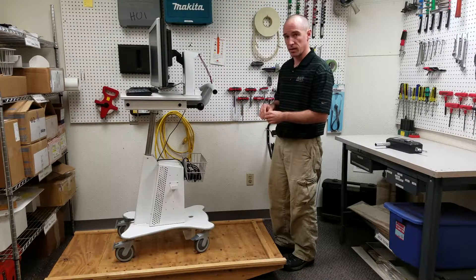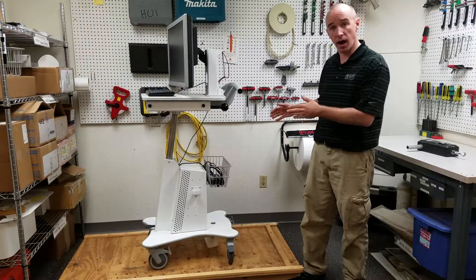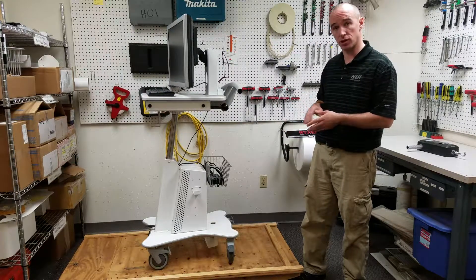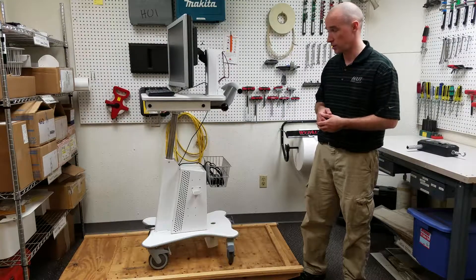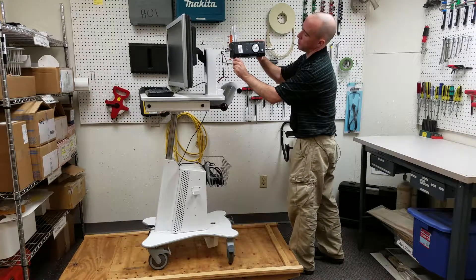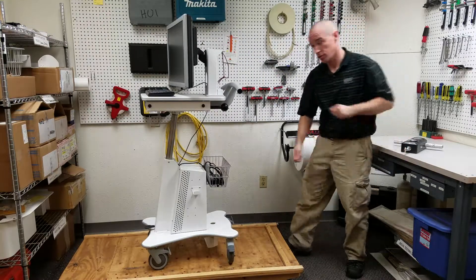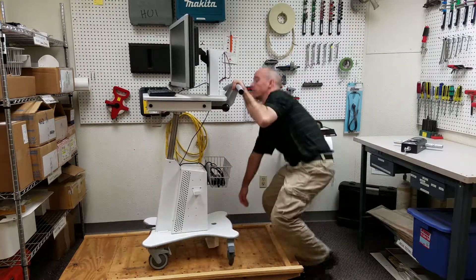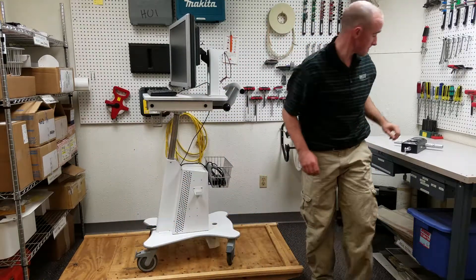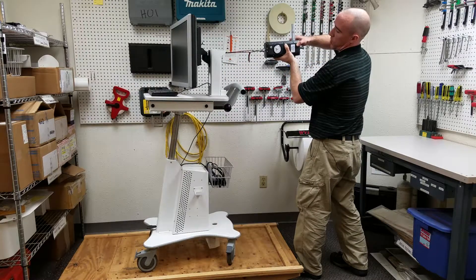What we'd do to fix this is move one of those locking wheels to the opposite corner so that we have equal braking forces on the cart. We've changed the configuration of our casters — now we have locking wheels on opposite corners. We're going to rerun the test, applying force in every direction and making sure the casters are in the least favorable position. We push on the cart up to 17.1 pounds, making sure there's no sliding — we're good. We change the wheels, apply 17.1 pounds — no movement.